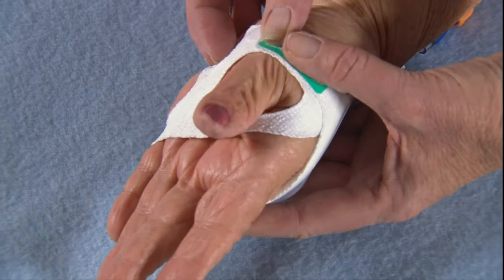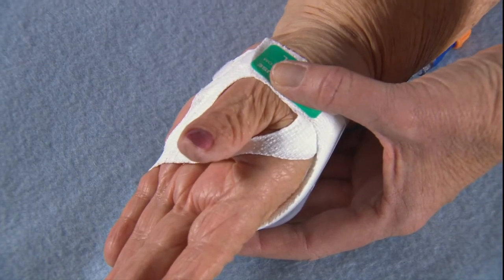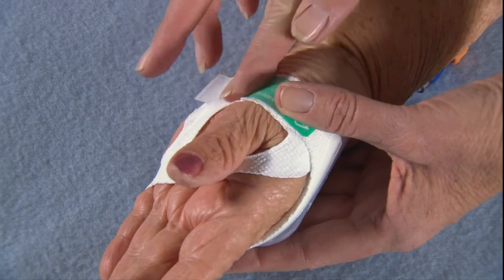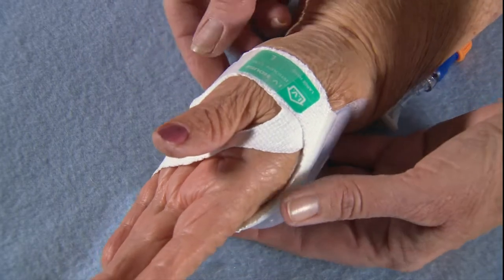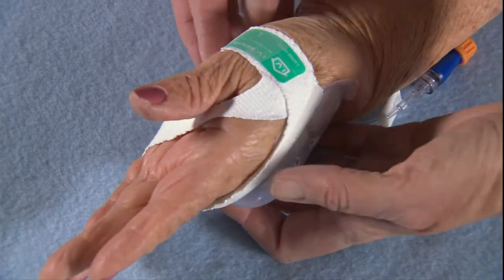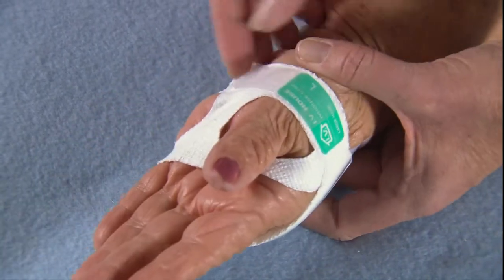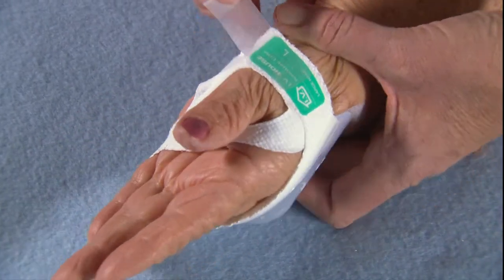For confused patients, a piece of tape may be used to secure the Velcro closure. Fold back the end of the tape to create a tab — later, this will make finding and lifting the tape easy. Release the Velcro tab to inspect the IV site according to your nursing practice guidelines.